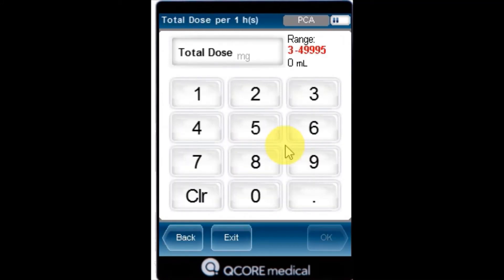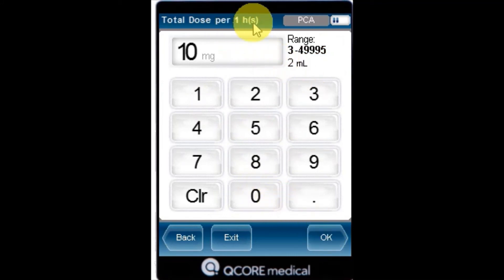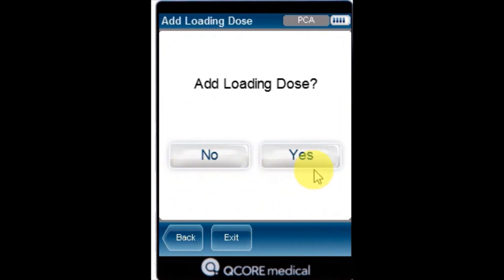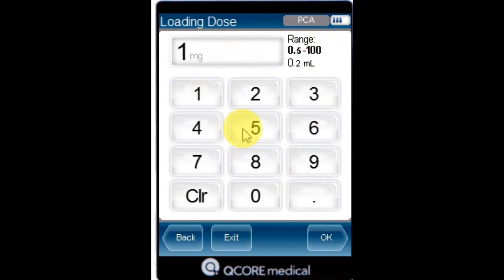Using the keypad, enter the maximum amount of medication that may be delivered within one or a four-hour period, and then press OK. The loading dose screen appears. Press Yes to add a loading dose. Using the keypad, enter the value for the loading dose, and then press OK.